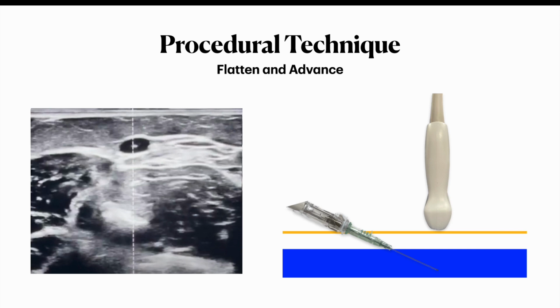I like to advance the IV as far as I possibly can, which will often mean that the catheter is inserted all the way into the vessel before I remove my needle. The only reason I stop this advancement is if the vessel suddenly twists, turns, dives deep, or if the needle tip gets too close to the posterior wall of the vessel. But most times I can insert the IV as far as it will go without having to remove the needle.